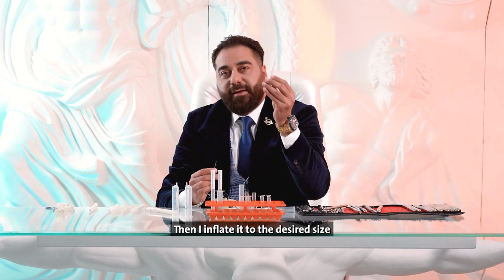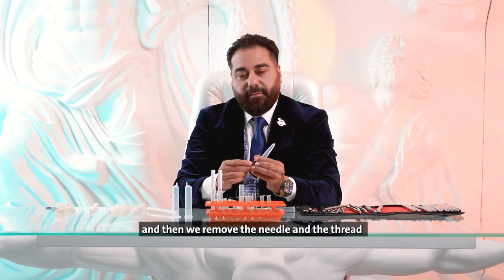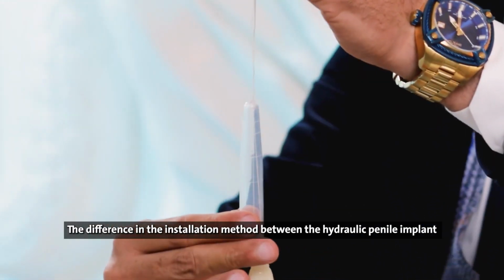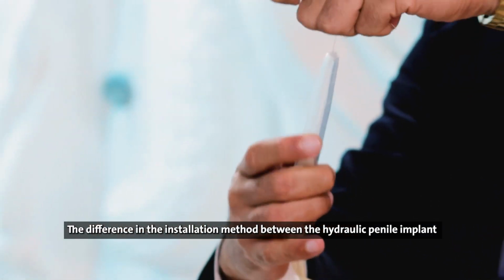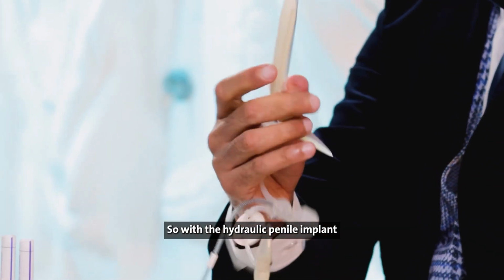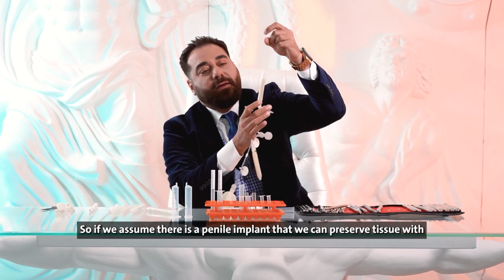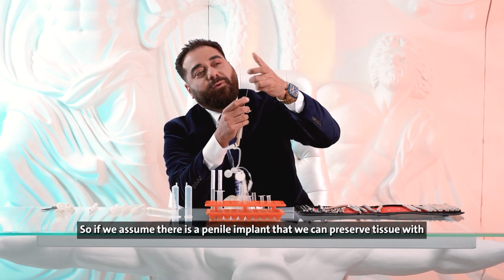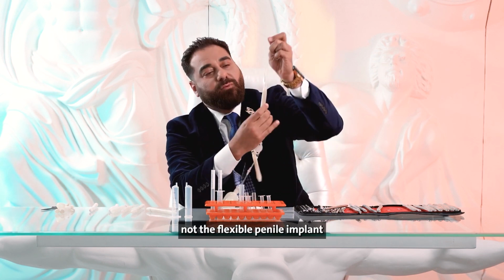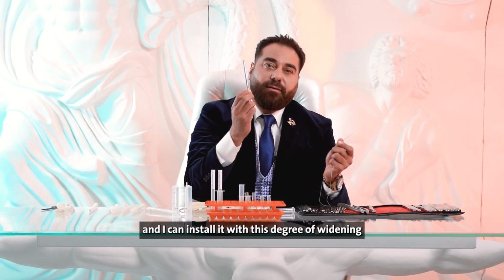I insert the penile implant through the needle and this thread, as you can see. Then I inflate it to the desired size, clear. So the hydraulic penile implant is installed, and then we remove the needle and the thread, and the penile implant remains inside the body. The difference in the installation method between the hydraulic penile implant and the flexible penile implant has become clear. So, with the hydraulic penile implant, I don't need to widen significantly. So, if we assume there is a penile implant that we can preserve tissue with, it would be the hydraulic penile implant, not the flexible penile implant, because the hydraulic penile implant is sufficient and I can install it with this degree of widening.